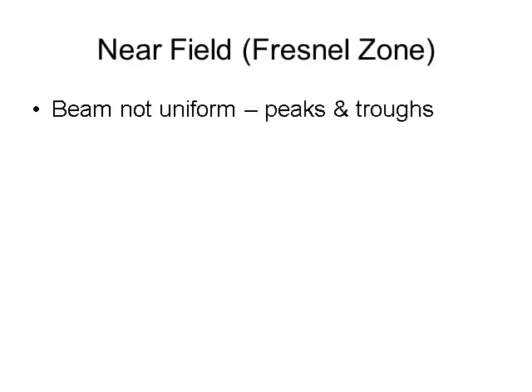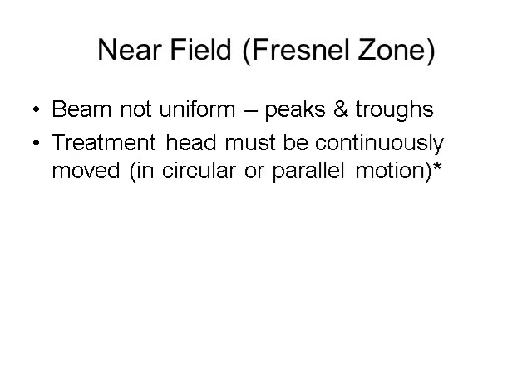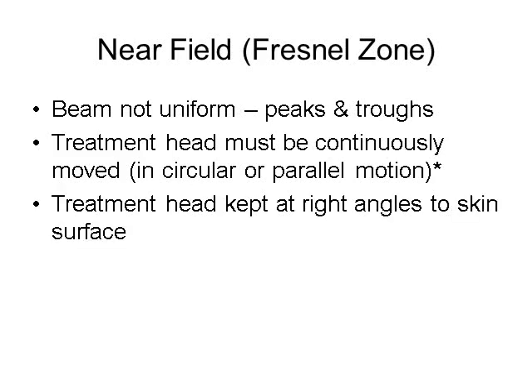In the Fresnel zone, there are peaks and troughs within the sound wave. Those peaks can be 5 to 10 times greater than the set intensity value. The treatment head must therefore be kept moving, usually in small circles or parallel lines. This prevents build-up of excessive energy in any one area. The treatment head is kept at right angles to the skin to ensure that there is adequate skin contact and that the energy is transmitted through the tissues in a more predictable fashion.